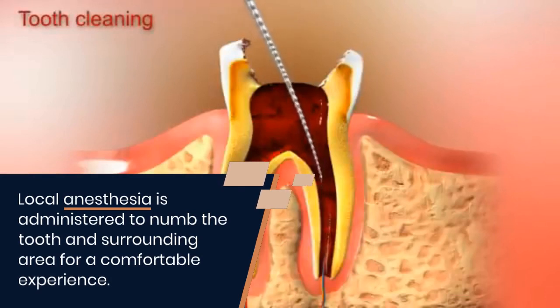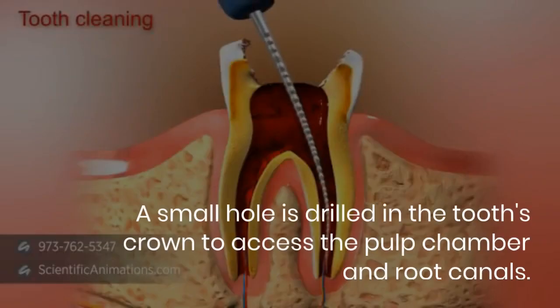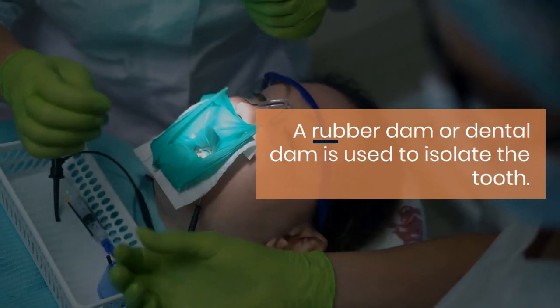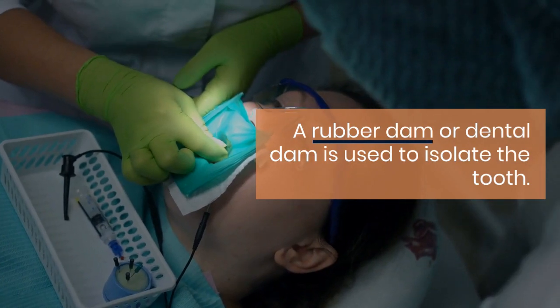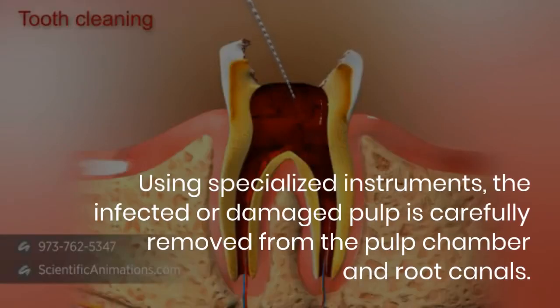Access and isolation. A small hole is drilled in the tooth's crown to gain access to the pulp chamber and root canals. The dentist will use a rubber dam or a dental dam to isolate the tooth, keeping it clean and dry during the procedure.